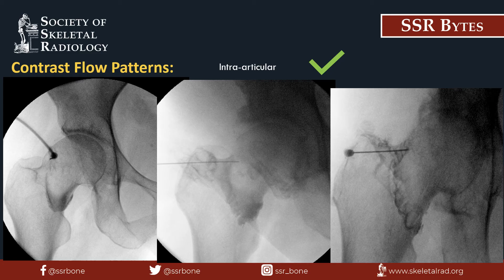Here are some additional examples of intra-articular contrast. The image on the left uses an eye of the needle approach with contrast along the lower aspect of the femoral neck. The middle and right-sided images use an oblique approach with contrast also along the inferior aspect of the femoral neck. The intra-articular contrast in the middle and right images appears less smooth in contour and slightly irregular compared with the left-sided image. This can be seen in the setting of synovitis of the hip joint and is a frequently encountered finding.